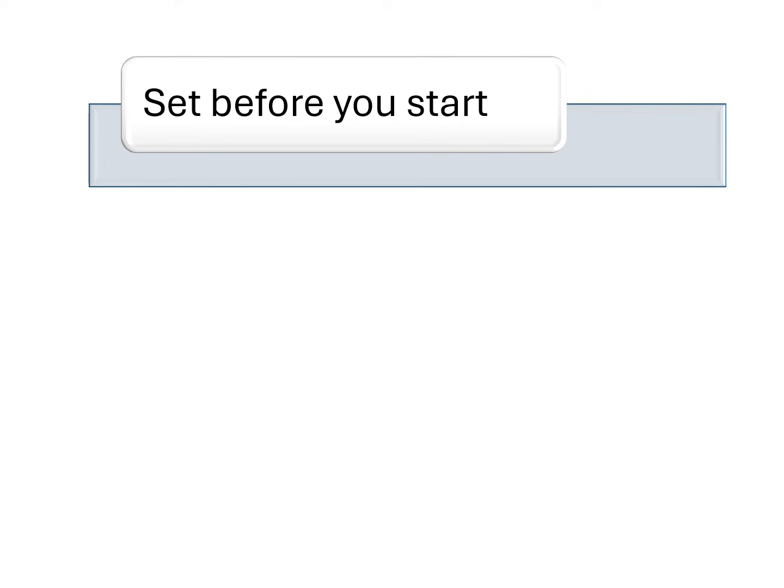Some tips. Set the ventilator before you even begin anaesthesia. It's a thing that you do before you even start pre-oxygenating the patient. And ask yourself honestly, who does this? But why wait until that moment when you've just strapped the endotracheal tube, you're bagging the patient, and now you're trying to remember what 8 mils per kilogram is for a 67 kilogram patient. Do it before, and then the settings are there on your machine, and when you press go on the ventilatory mode you've chosen, it will just kick in.